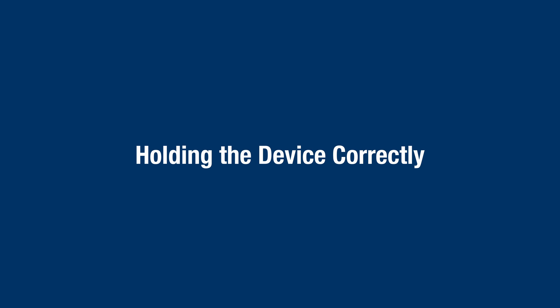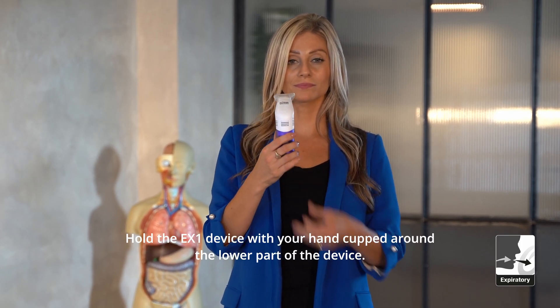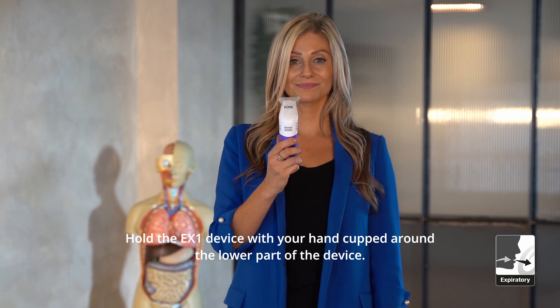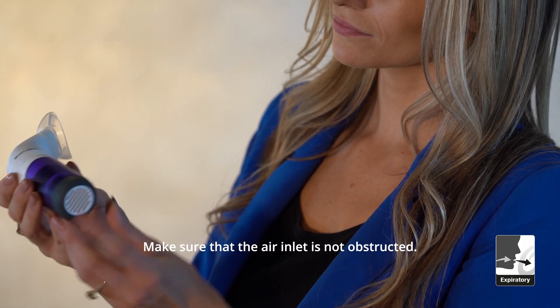Holding the device correctly. Hold the EX1 device with your hand cupped around the lower part of the device. Make sure the air inlet is not obstructed.